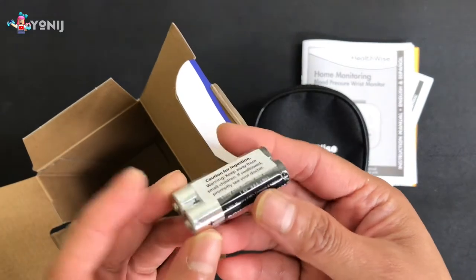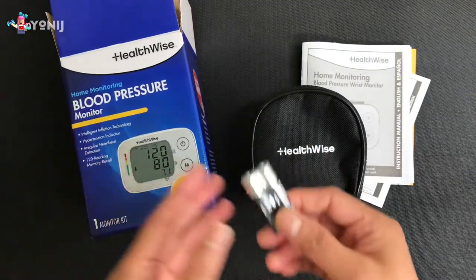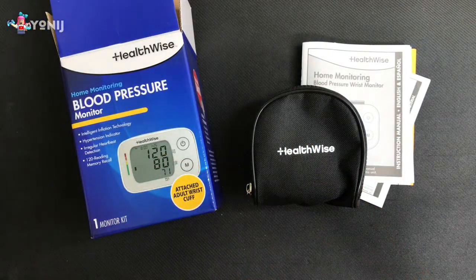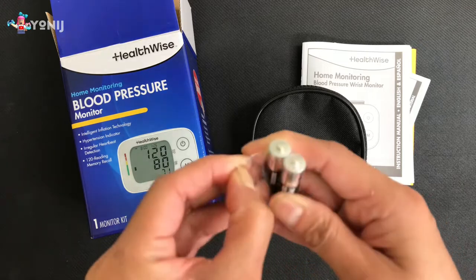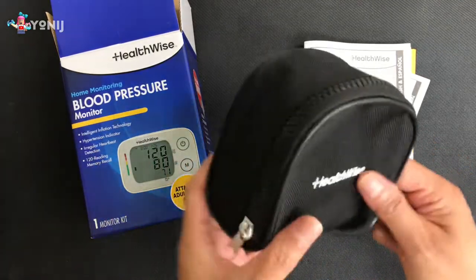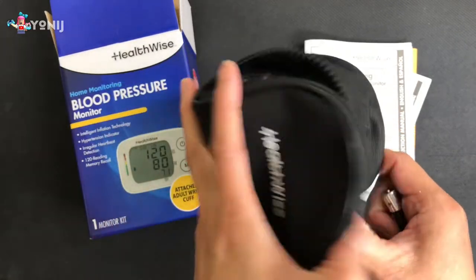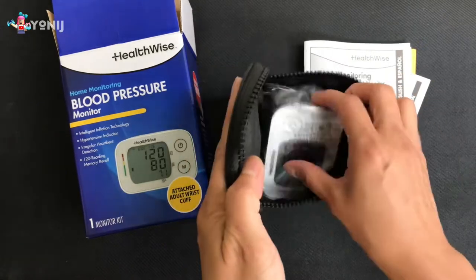The last item is — double A? Triple A batteries, I think. Yes, it comes with two triple A batteries, which is a good thing. So if you're planning to give this to someone who doesn't have batteries laying around the house, you're in luck because it comes with batteries. I like the zipper on the pouch — it's a big kind, so hopefully it'll last a long time.